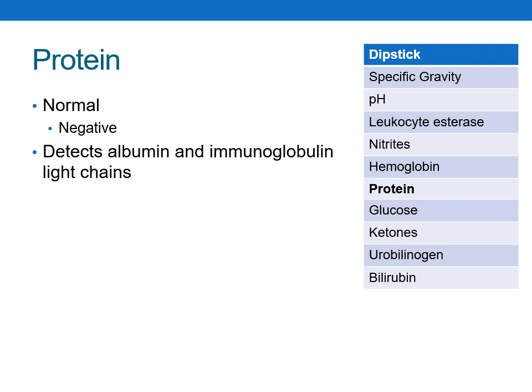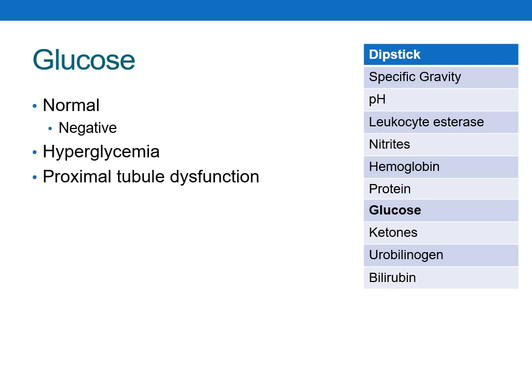Protein is yet another item that is not normally found within the urine. If this test result happens to be positive, it could indicate renal disease. The glomerular capillary is only permeable to low molecular weight proteins at baseline, which should limit the amount of large proteins in the urine. This test is specific for albumin and light chain immunoglobulins, which are considered heavier proteins and should therefore not be present in the urine. So things to consider might be renal disease, but it could also be due to damage from medications, and even stress or exercise can lead to protein excretion in the urine.